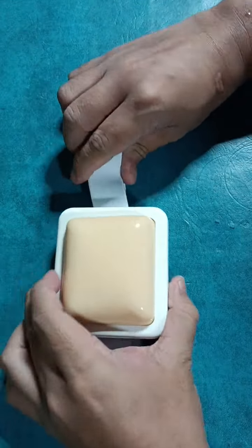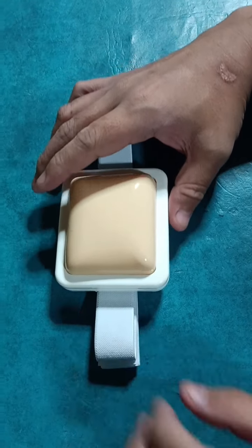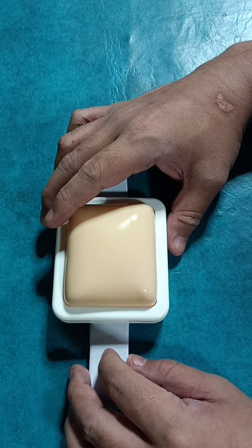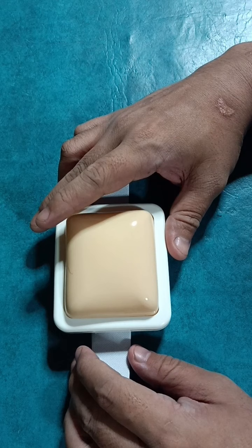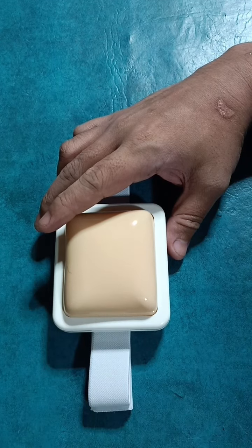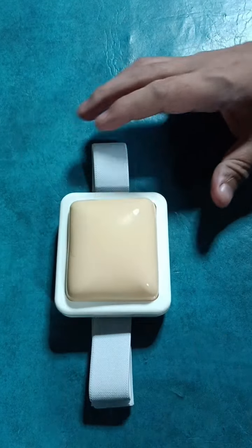Since we don't have any model to do the procedure, here's the sample injection pad. Commonly, subcutaneous injection is performed in the abdominal part of the patient.